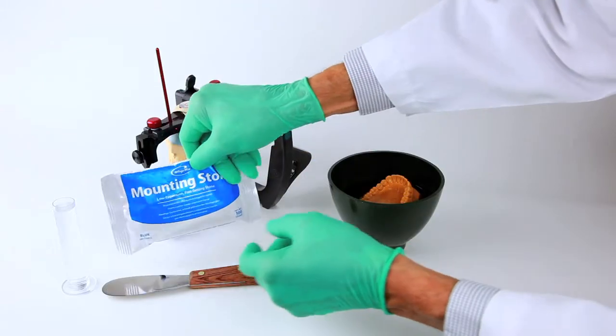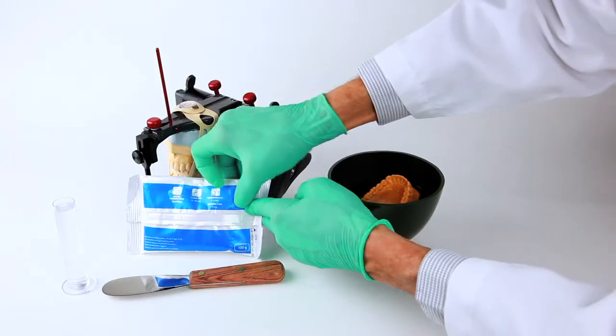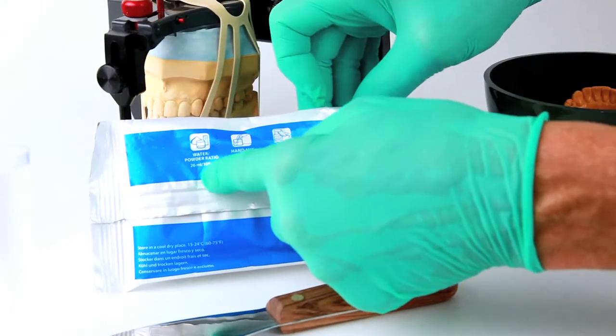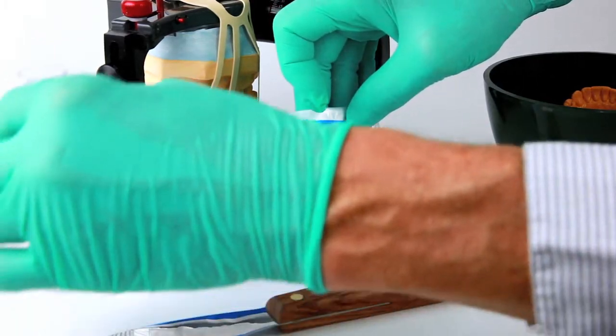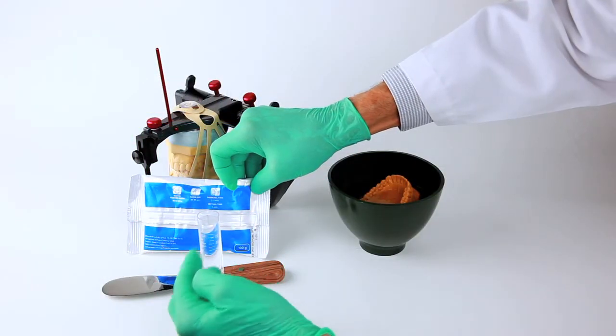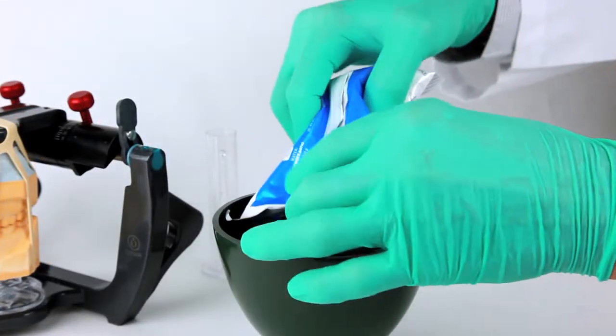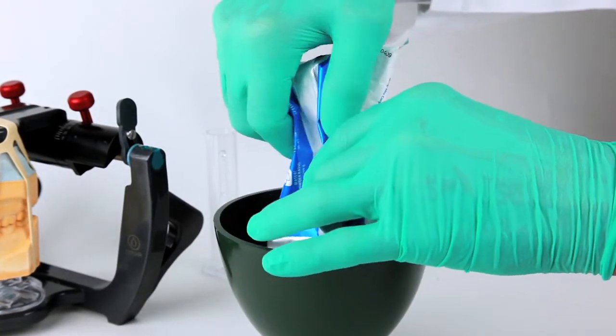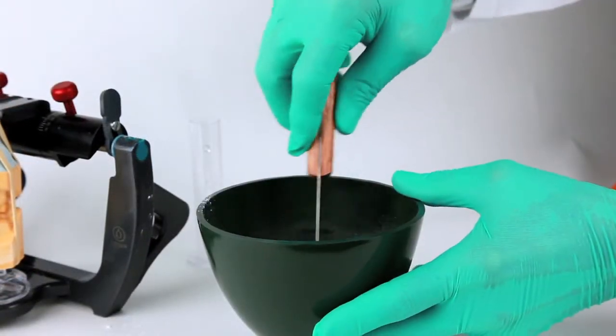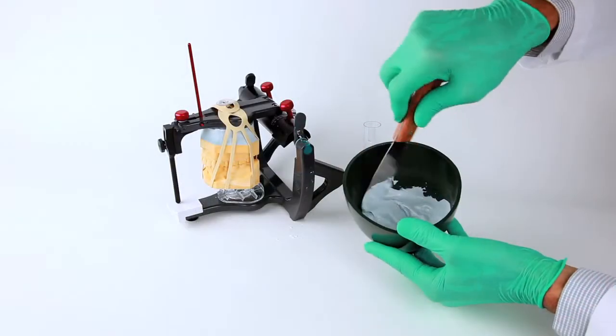At this time, we are now ready to mix the mounting stone or plaster, paying attention to the proper water-powder proportions so that an ideal consistency and setting expansion can be obtained. This is accomplished by placing the water in the mixing bowl first and then adding the powder to it, mixing to a smooth, creamy consistency.